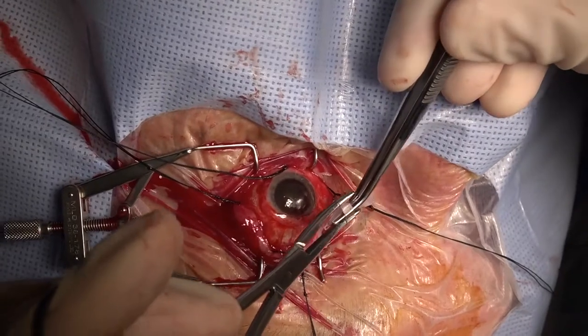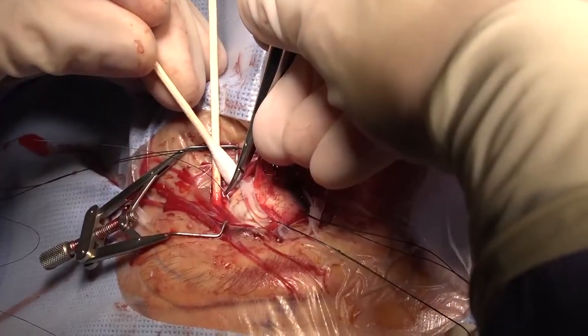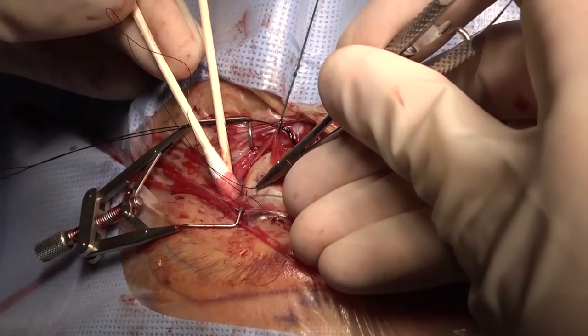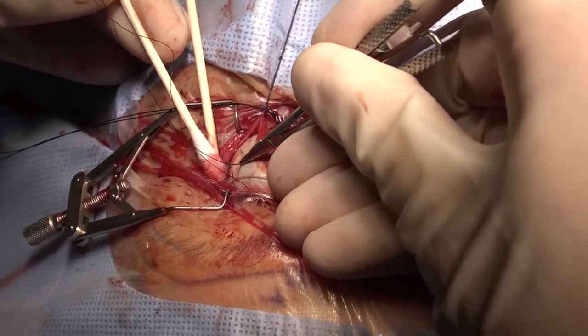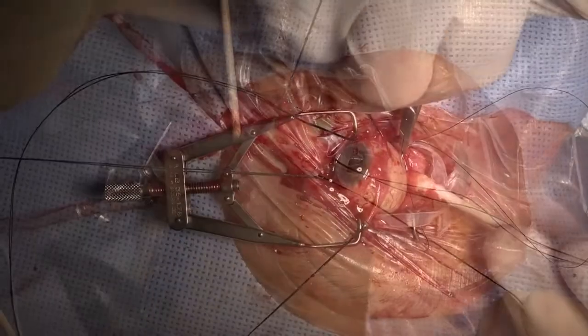Next, we secure the ends together using a number 70 silicone sleeve. We then place a mattress suture in each quadrant, four in total, in order to secure the band in place and make sure that the band is in the correct anterior-posterior position in order to properly support the vitreous base.